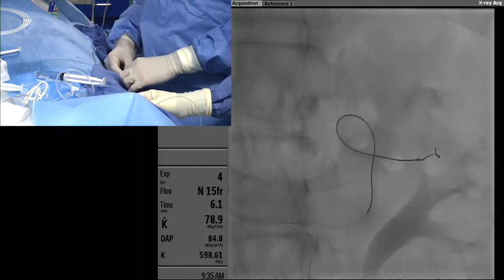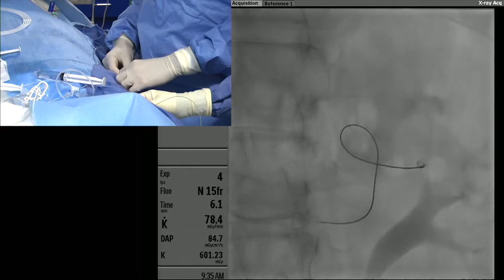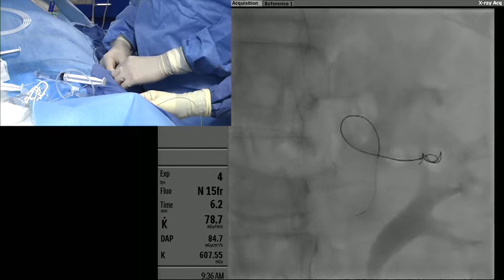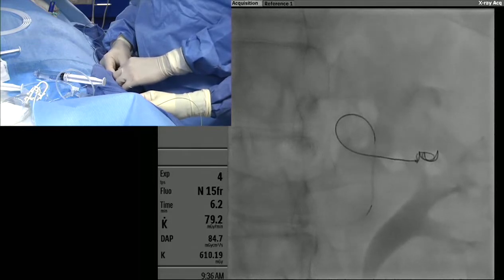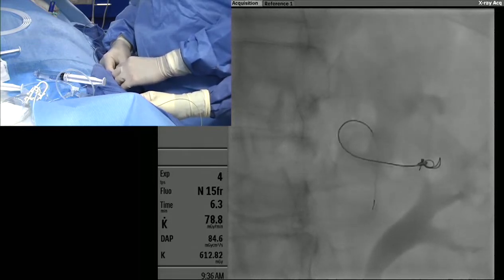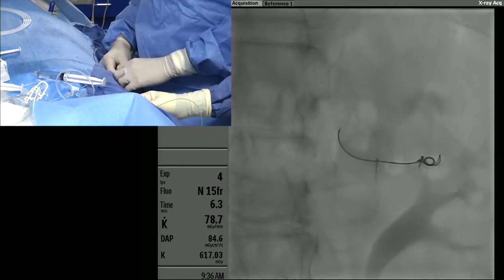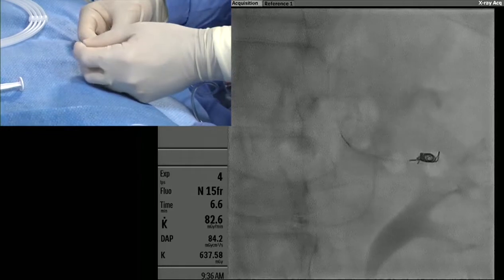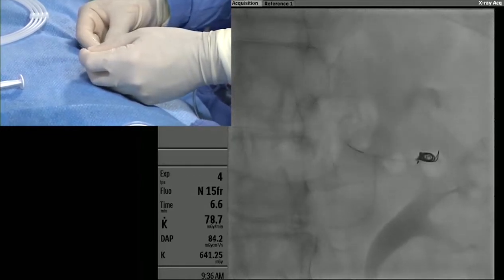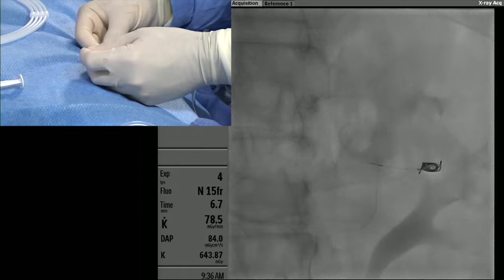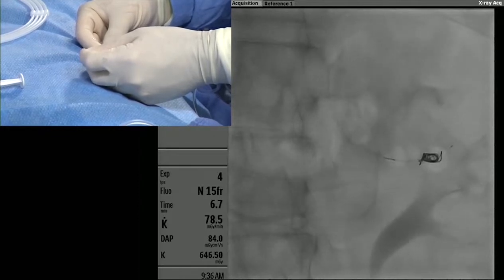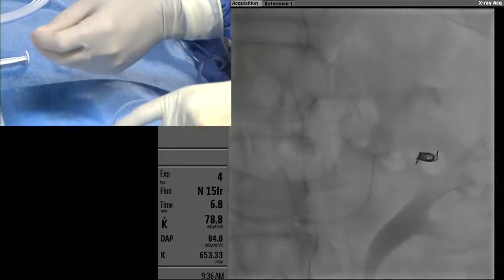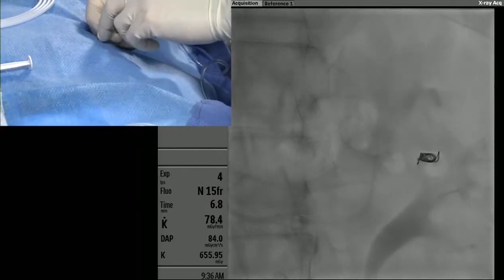We're playing with the coil a little bit to see if we can get it to sit. I'm starting to like this positioning — if we can get it to sit I think we might put in one more, then move back into the aneurysm. The radiopaque marker is coming out of the microcatheter and it's not until it separates — you actually saw it separate on screen — that I can retract it and the coil stays in place.